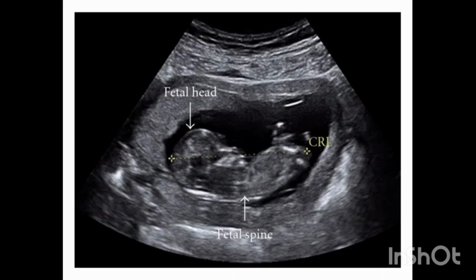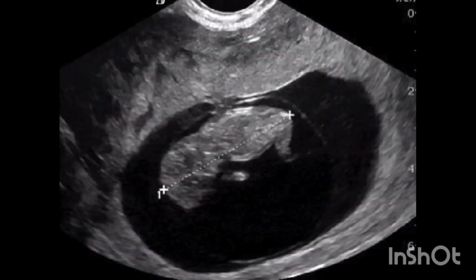There are no significant differences with measurements made by the transabdominal route or the transvaginal route, although transvaginal scan provides superior resolution and more accurate identification of the embryonic structures than abdominal ultrasound. The accuracy of crown rump length measurements in determining gestational age is within 3-5 days. There is an optimum window for crown rump length measurement, which is between 7 and 9 weeks using transvaginal scan.